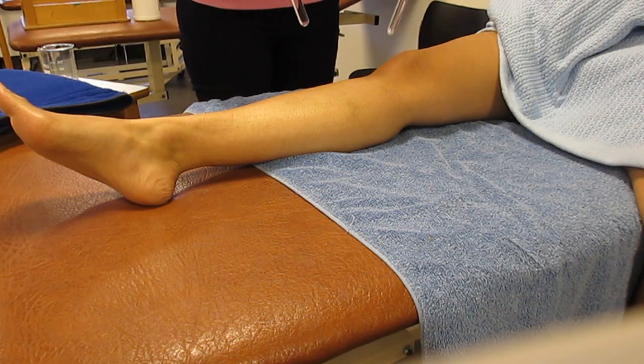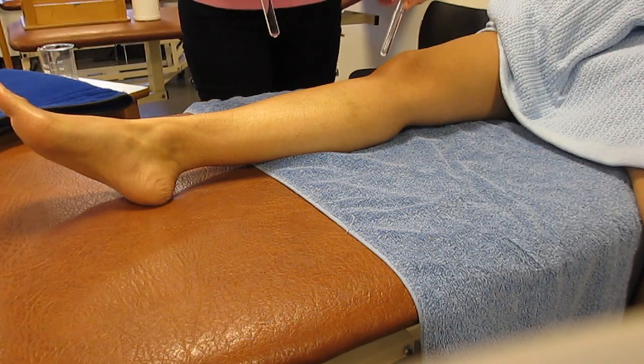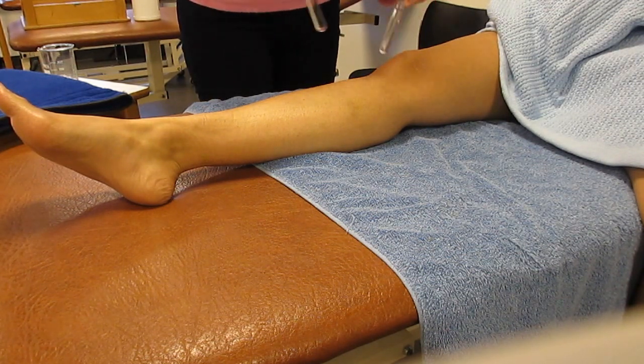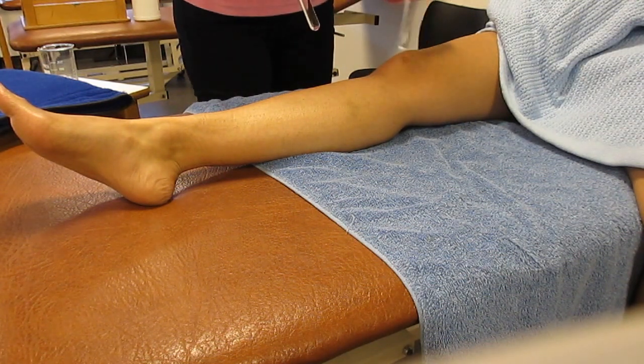So is this one hot? Tell me — this is hot and this is cold. Okay, close your eyes. Right, now which is which? The patient correctly identifies: hot, cold, cold, cold, hot, hot. Fine — so we've just checked the skin sensation there.